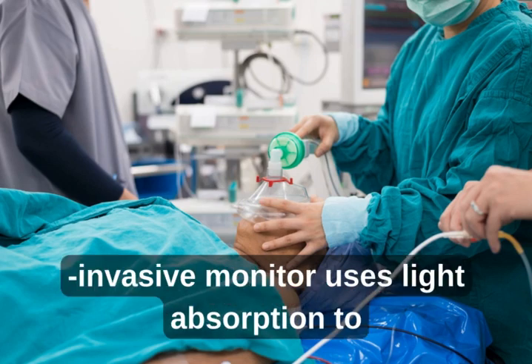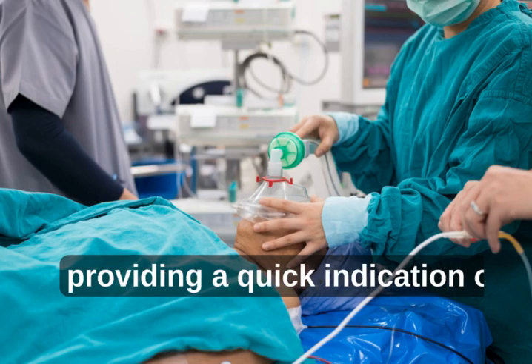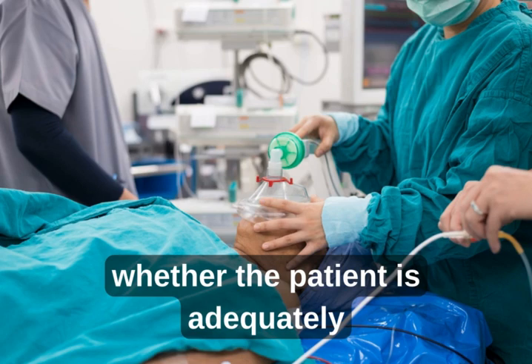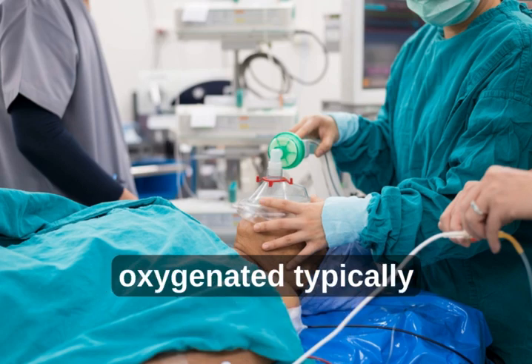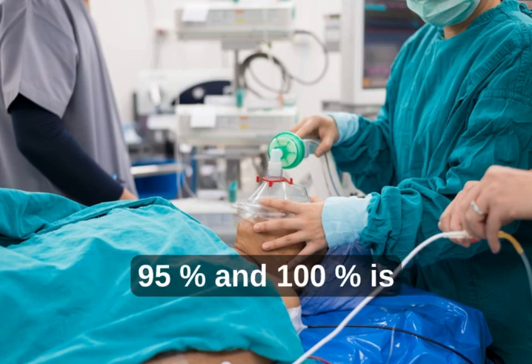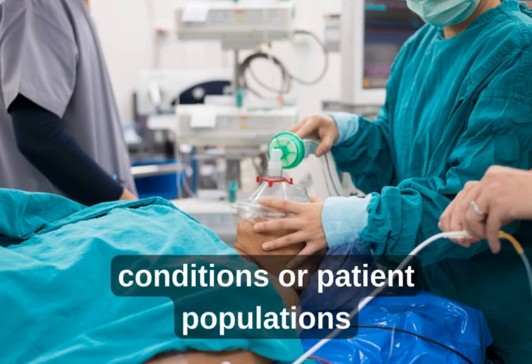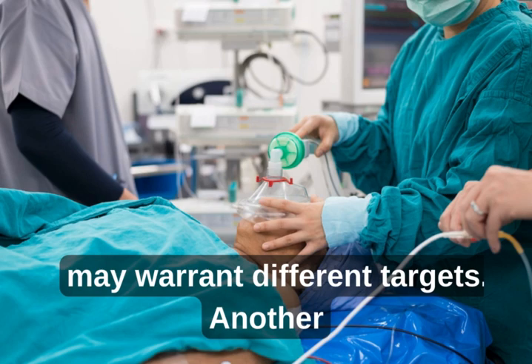This non-invasive monitor uses light absorption to measure oxygen levels in the blood, providing a quick indication of whether the patient is adequately oxygenated. Typically, a saturation level between 95% and 100% is considered normal, but certain conditions or patient populations may warrant different targets.